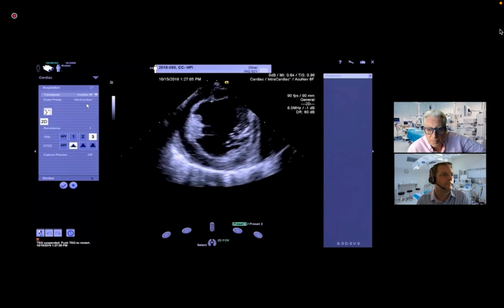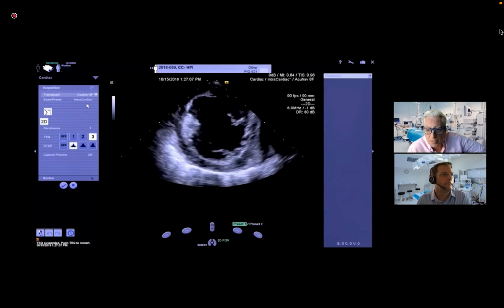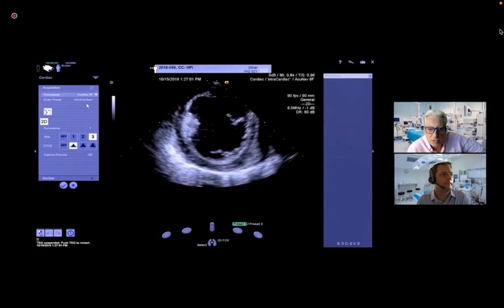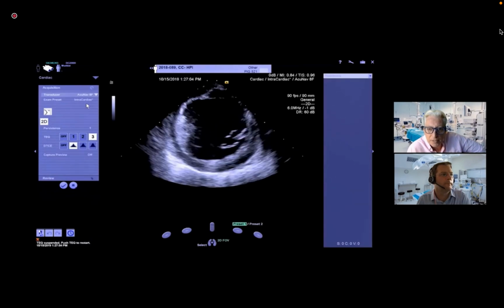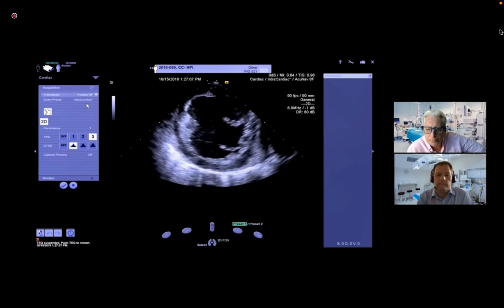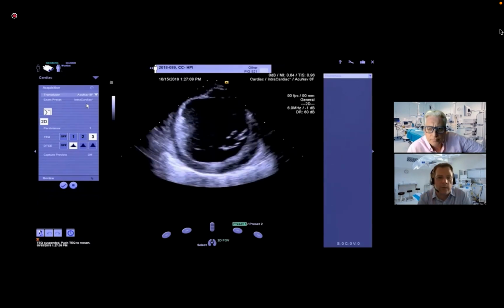So for those of you who are very experienced at this, you'll be able to spot it straight away as being good ventricular function. For those less familiar, the thing to remind yourself of is to focus on the middle of the donut and watch everything thicken and come towards that central point. So that's a pretty normal looking echo to you then, Monty?